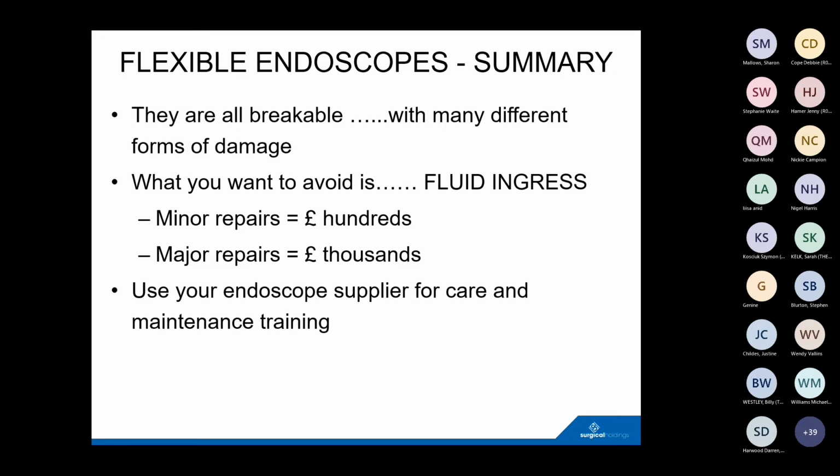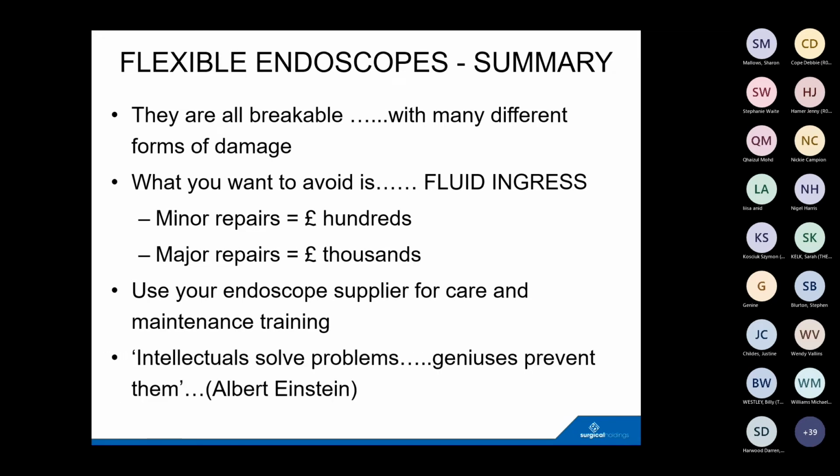And prevention really is the issue. And I leave you with a quote from Albert Einstein: "Intellectuals solve problems, geniuses prevent them." You won't get any thanks for preventing something because no one perceives that anything's been prevented, but by preventing a lot of issues, you will save the hospital huge amounts of money and keep the uptime up for the clinicians and the patients.